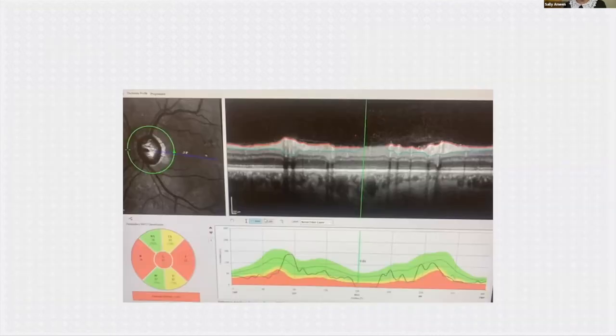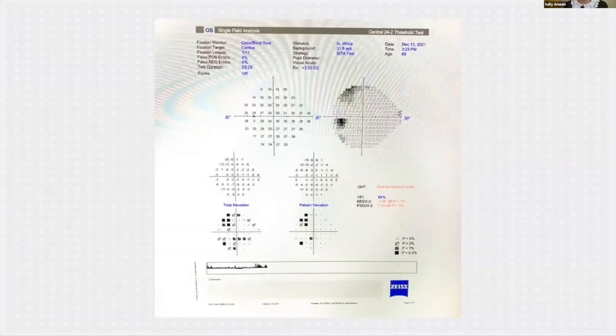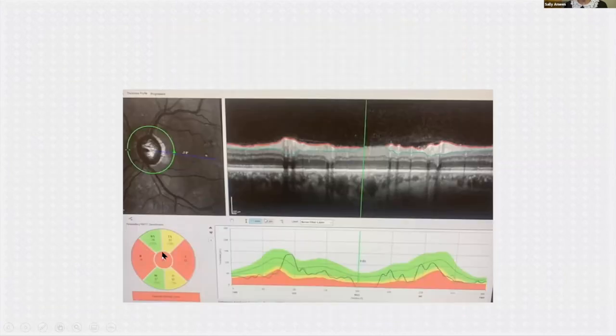So the next patient is a lovely young lady who, as you can see, I saw today in the clinic, and this is her disc OCT. As you can see, there's already quite a bit of damage going temporally, starting superiorly and inferiorly, as well as nasally. The other eye pretty much looks exactly the same. When you look at this optic disc, you're worried that she's wiped out most of her visual field, and actually her pressure was 35 on oral Diamox as well.